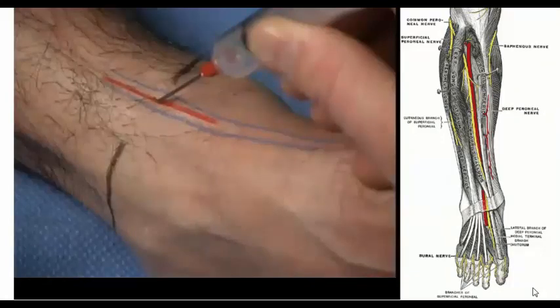Withdraw the needle and redirect 30 degrees laterally and then medially and provide an additional 3 to 5 milliliters of anesthetic. If anesthesia in a saphenous distribution is also desired, bring the needle back to the level of the subcutaneous space and redirect it medially. Inject approximately 5 milliliters in the subcutaneous space. This will block the saphenous nerve.